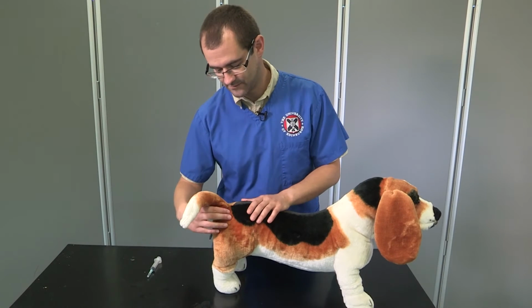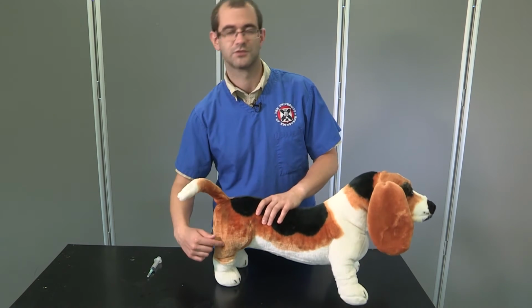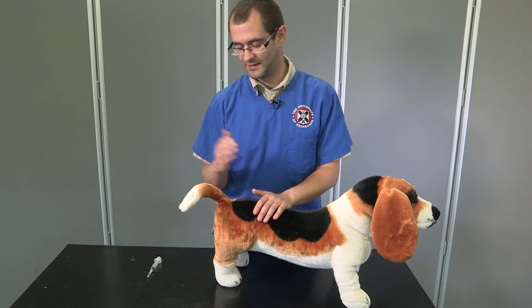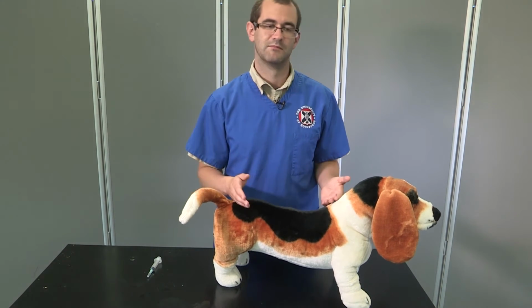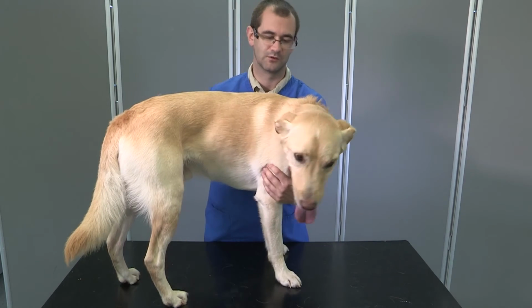We tend to avoid the caudal aspect of the hind limb. This is mostly because the sciatic nerve runs through the musculature here. We don't want to inject in or around the sciatic nerve. As you can imagine, that's pretty painful, and you can cause damage to the sciatic nerve and cause lameness or pain. So now we're going to discuss sites for intramuscular injection with the live dog.